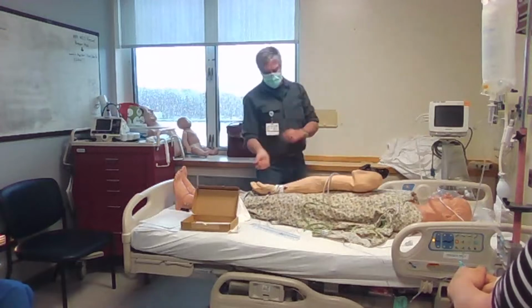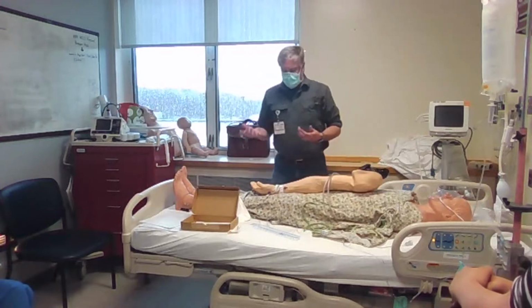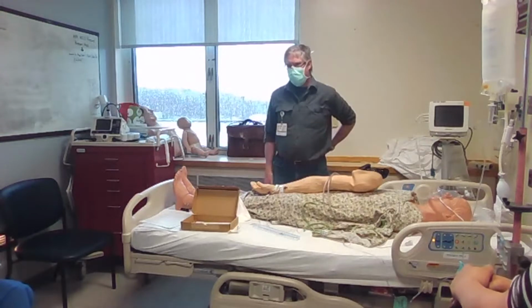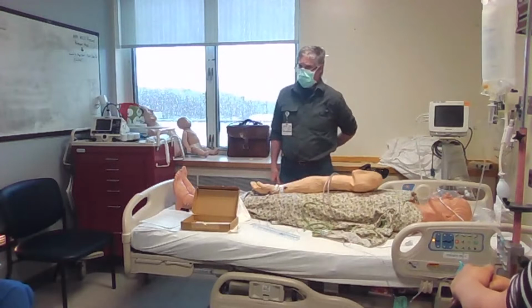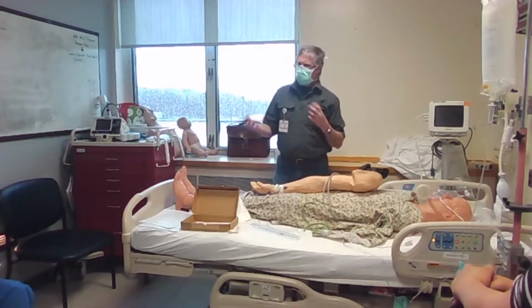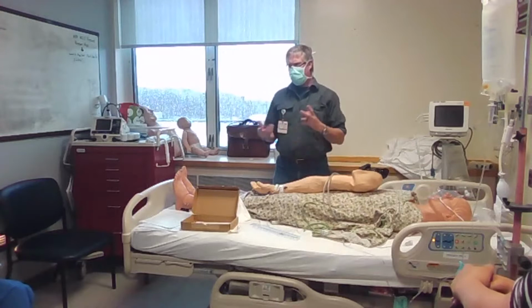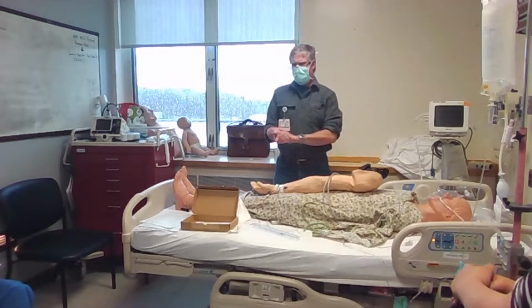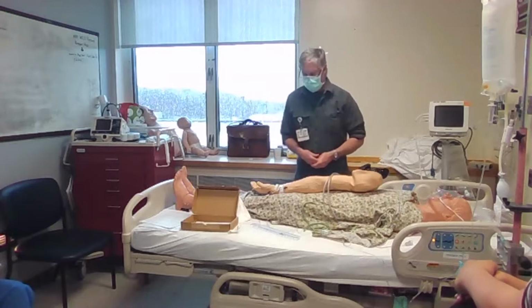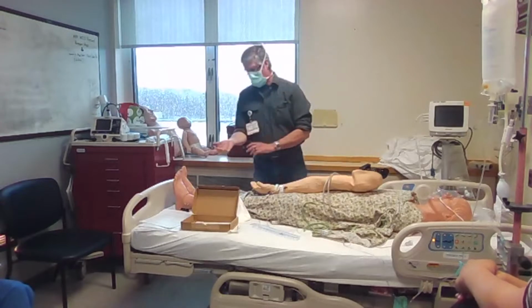Do you do the Allen test at all? Do you worry about that? So that's something that's always taught. Yeah, I've never done it. Okay. I've never known anybody who did it regularly. And especially in older people, it's really hard because you can get really false positives, because they've got all these atherosclerotic plaques in their radial artery and things. You just never really know. But I'll go over it real quick.